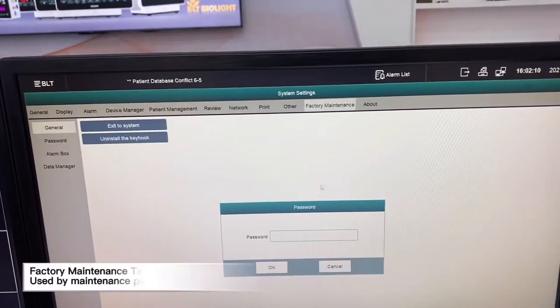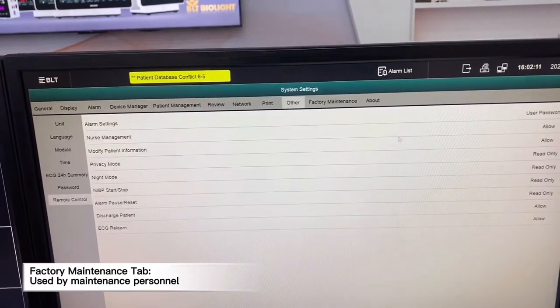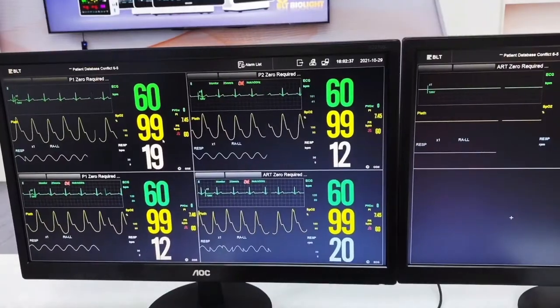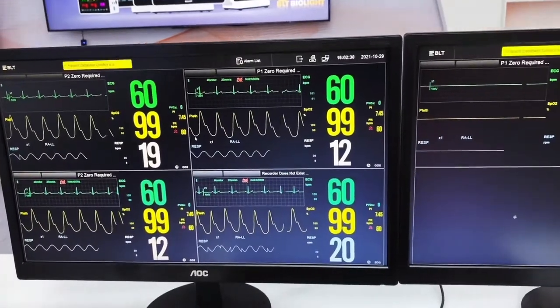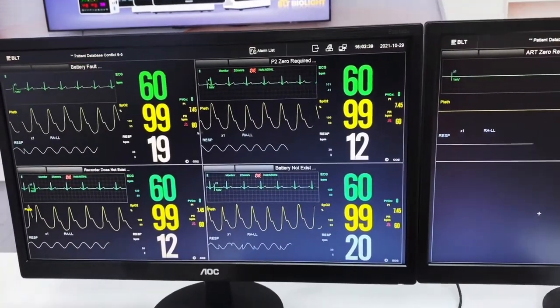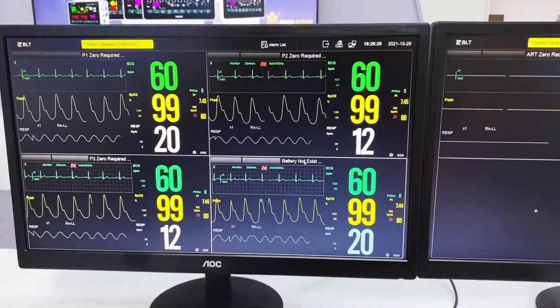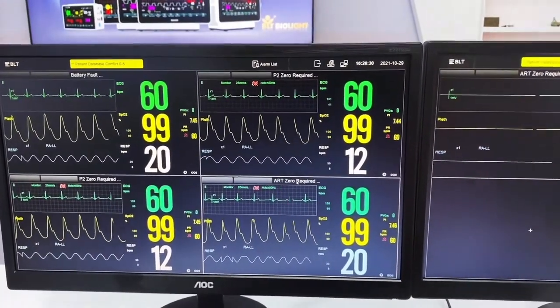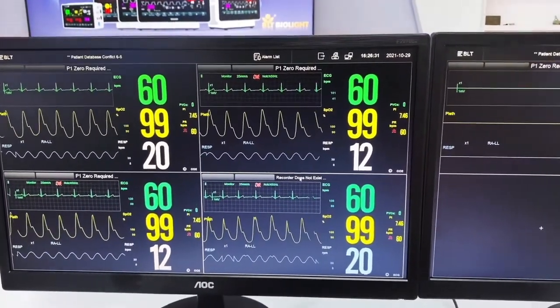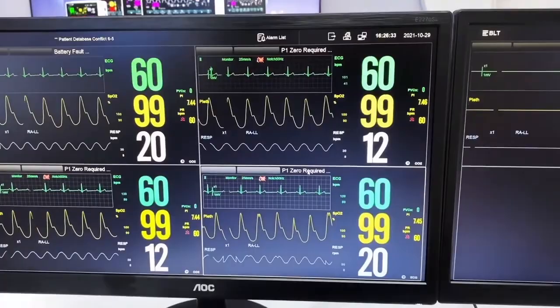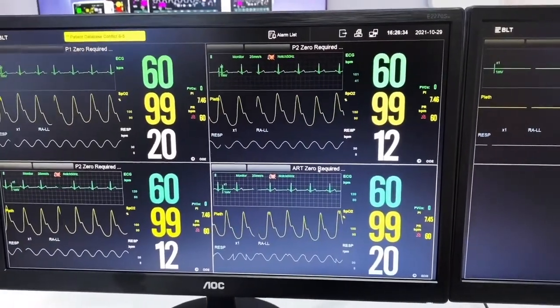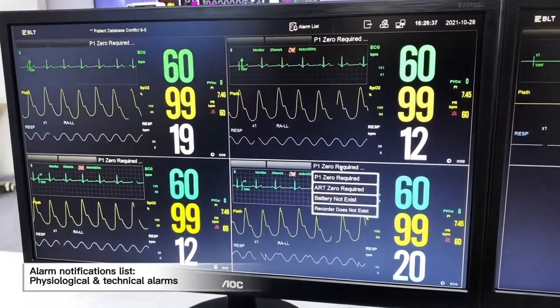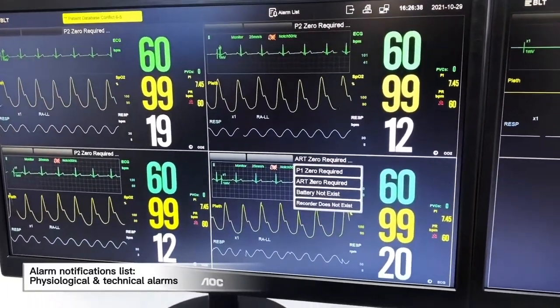This is factory maintenance. When we go to the main page on the interface, we will be able to see the notifications. Once we click on it, we will be able to see the physiological alarms and technical alarms.